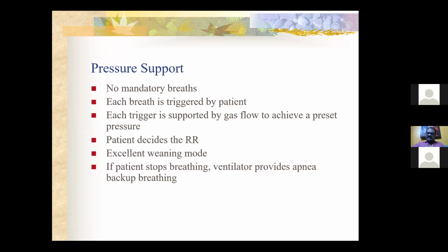It is starting with ACMV, going to pressure support mode, and the only problem is if the patient stops breathing in between, the machine will be sensing, and there will be something called an apnea period. Usually it's 20 seconds, the apnea time. The machine will wait for 20 seconds to check whether the patient is breathing on its own. And for some cause, the patient is not breathing in between. The machine will wait for 20 seconds.